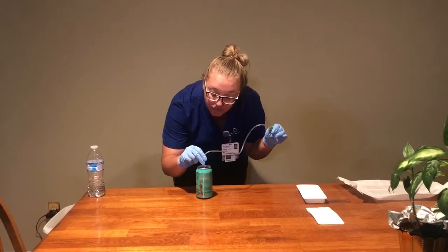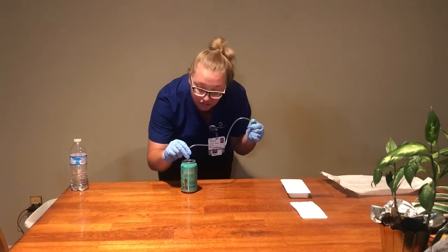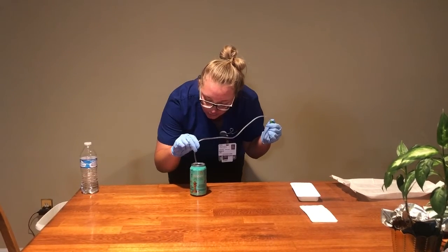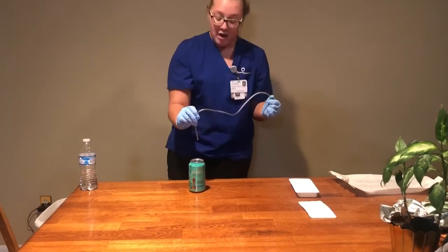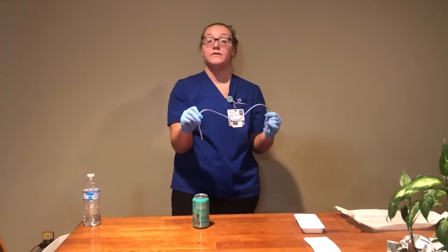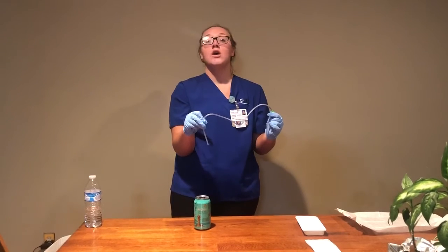And then after that, I'm going to do intermittent suctioning. So I'm going to cover it, and while I suction, I'm going to rotate it in a circular motion while taking it out. And so then after that, I would make sure that I do not do this for no longer than 10 to 15 seconds because it can cut off my patient's oxygen supply.